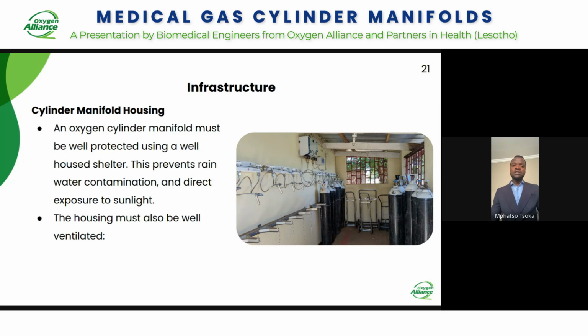Also there is the risk of manually or physically handling the cylinders, moving them from place to place. Now the pipeline is there, the manifold is there, and oxygen can just move in a pipeline towards the patient area, which also reduces the space that used to be occupied by the cylinders themselves. Now they're no longer kept in the wards where the patient is. So oxygen is just moving from point to point. Thank you so much for the presentation.